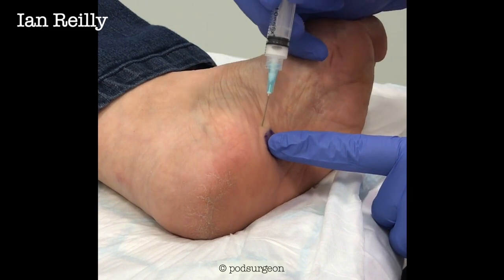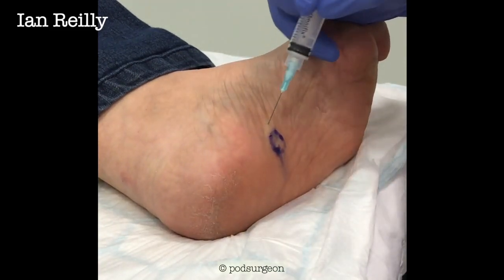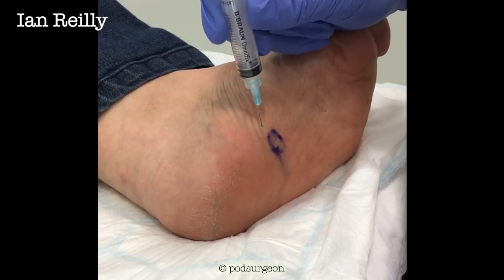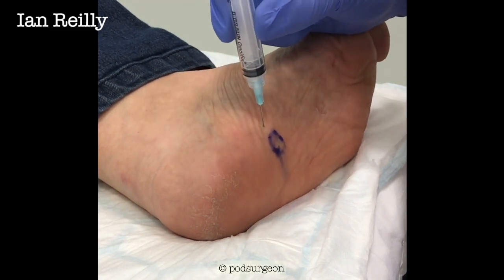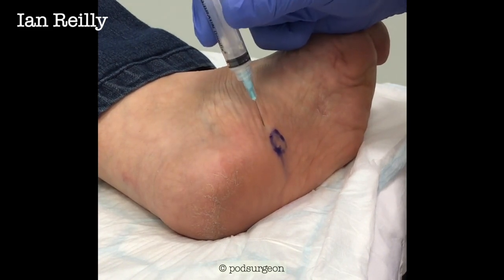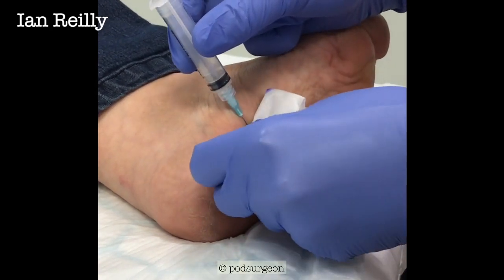My patient's just pulling a little bit of a face. So that's all the steroid in. And then it's the needling that really helps break down that tissue. You can really feel where it's thick and get that real resistance there. So we're into skin there, and then there's the lesion — feel the resistance. She's saying it's fine. And that's us done.